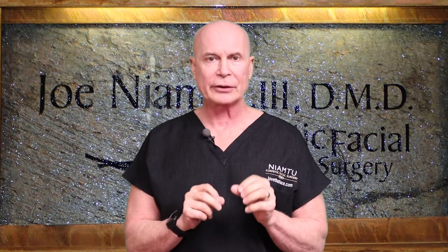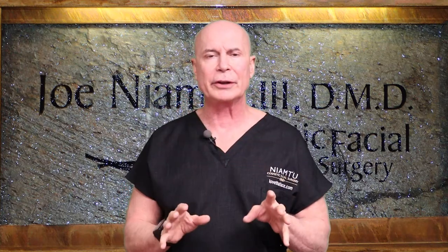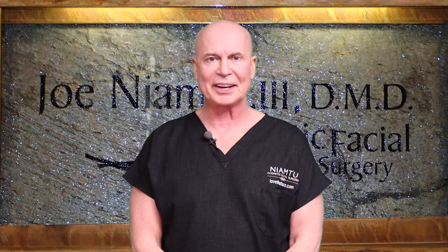In this video we're going to show you how to care for and use a drain. Not every facelift patient will have a drain — once in a while we use what we call vents, which is just a gravity drain, and we have another video for that. But if you have the bulb drain with your facelift, we're going to talk about how to take care of that.